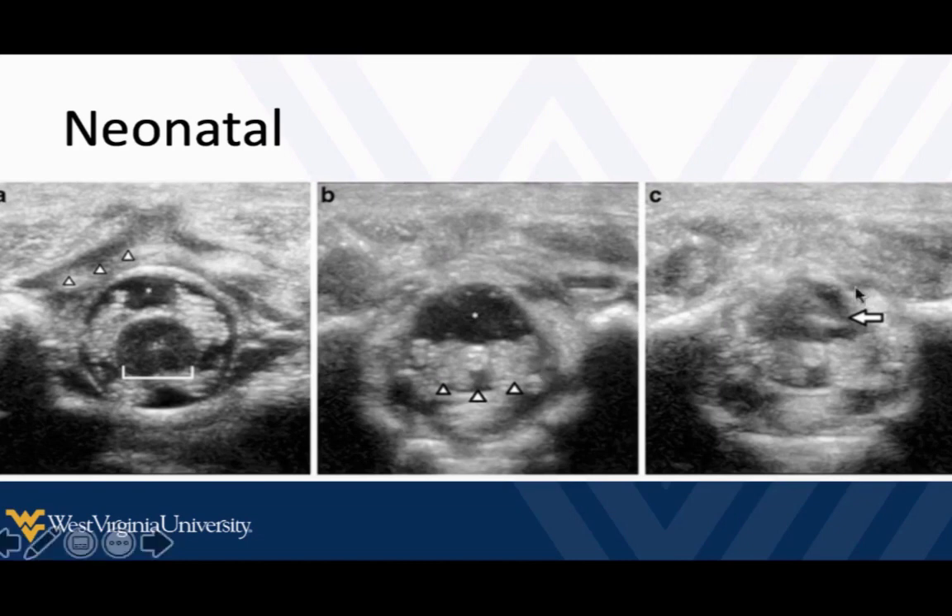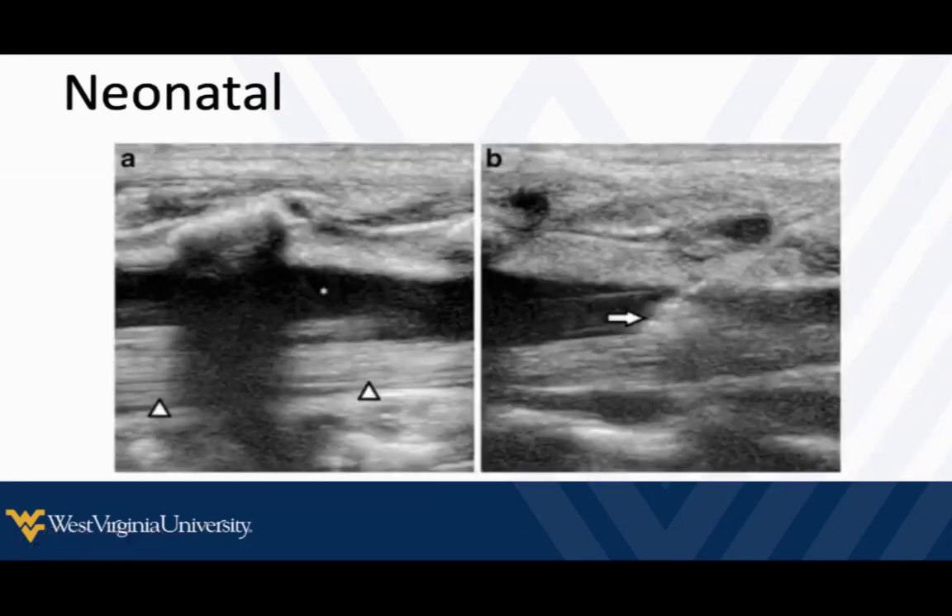Going all the way down even lower, there's not much fluid left. In neonates, if we use a nice sterile technique and a sleeve on the probe, we could actually real-time guide our needle into their CSF if need be. Looking at this in long axis, we can see the cauda equina itself here, and our spinal fluid. In this scenario, they've actually done a real-time needle guidance technique, which you can do.